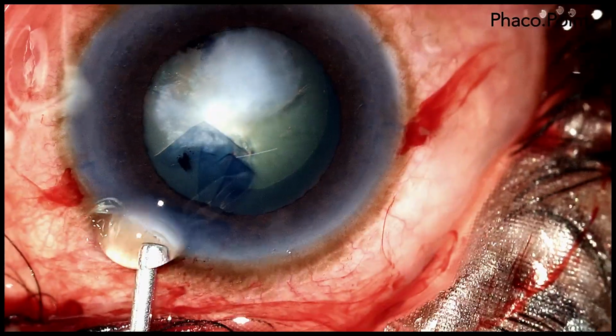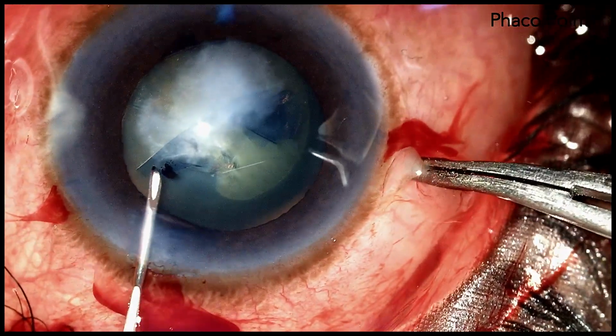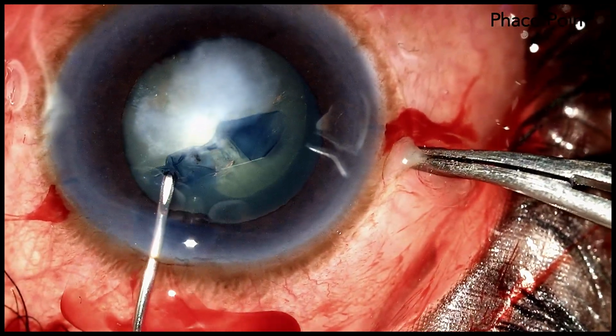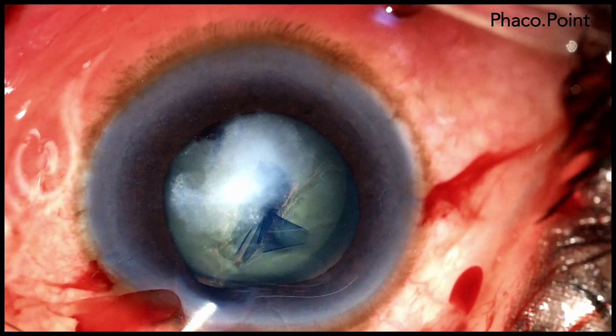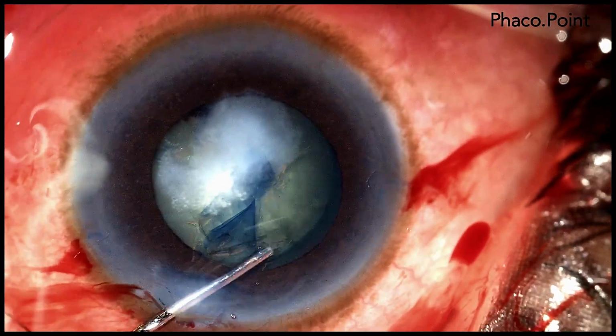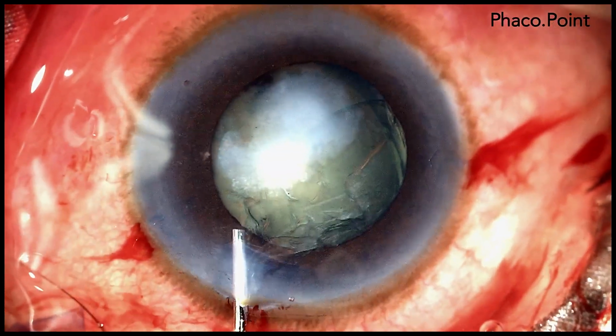After which, once more I put some viscoelastic into the anterior chamber, and now as you can see, I'm successfully able to complete the rhexis. Next, I decompress the anterior chamber, removing some amount of viscoelastic, and proceed with the hydrodissection on either side.